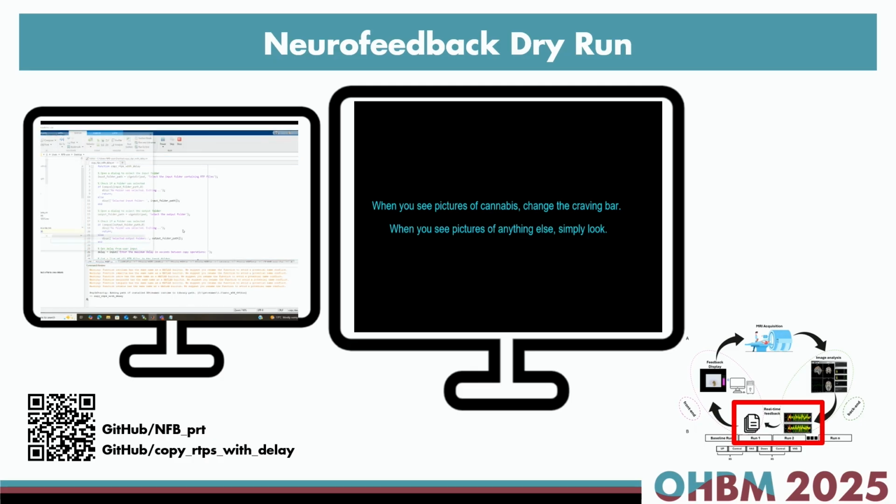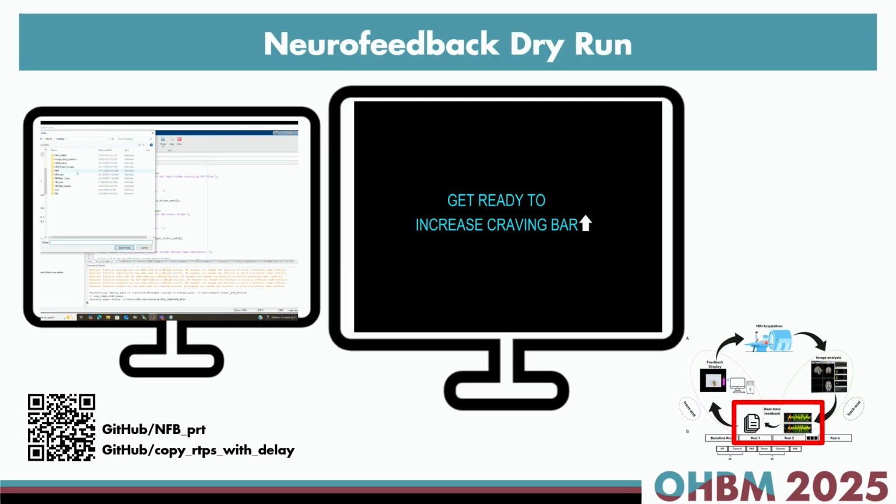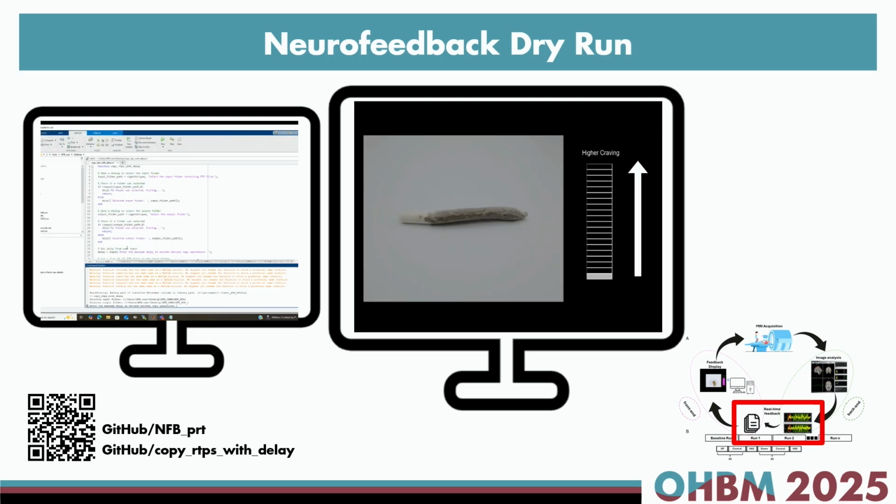So again, you can get the same results, and you can see that your task will find those RTPs somewhere and can try to show if the thermometer is working and if it goes up or down. So as a dry run, you can use this code to access these RTPs in real time.